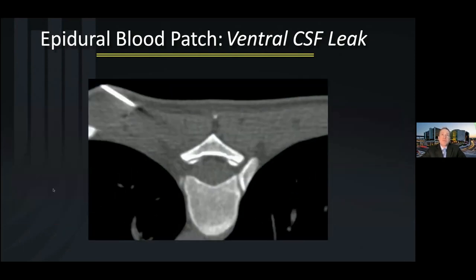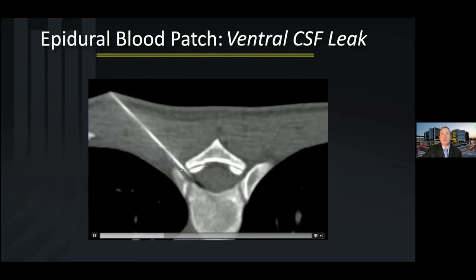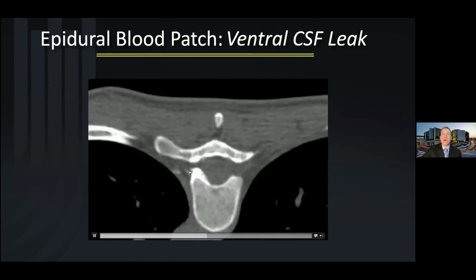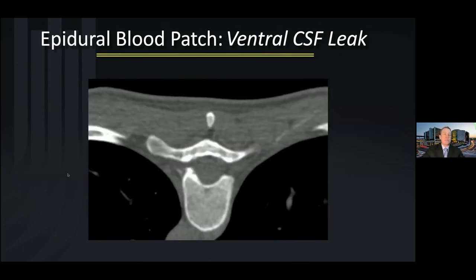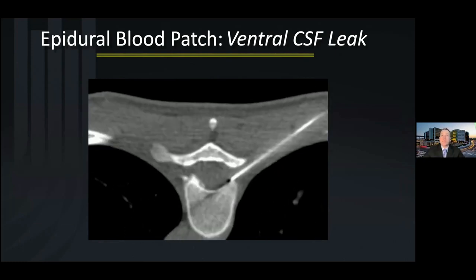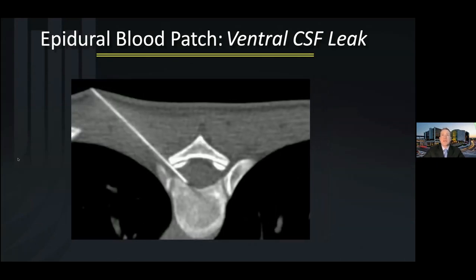This is what this looks like with straight needle approaches. This is not for the faint of heart. We are driving the needle up here. The dura is right here. The spinal cord is in there, and we have to run it past the nerves and the arteries there in the foramen in order to achieve access to the ventral epidural space. It currently requires bilateral placements of the needles in order to get this done.